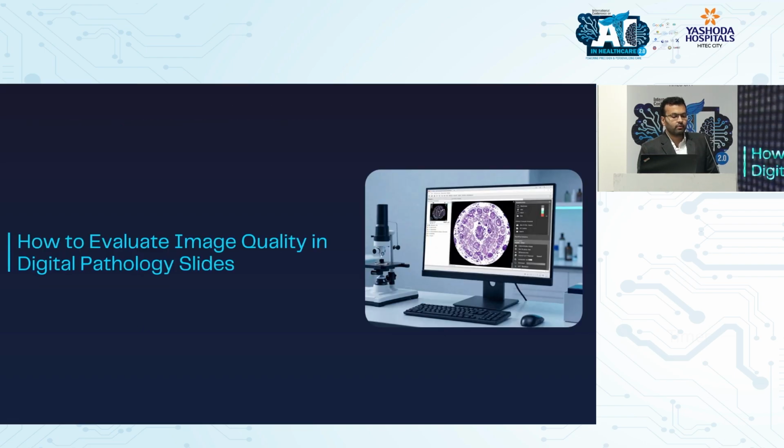Right, so how do you evaluate image quality in digital pathology? Okay, so image quality, the simplest way is, this is my microscope, this is what it looks like, the screen has to look the same, right? That is how I looked at it when I first decided, okay, I should go for a scanner. And then Dr. Tapadia gave me a paper which he asked me to go through, where it said that, okay, these are the technical things that I need to look into.